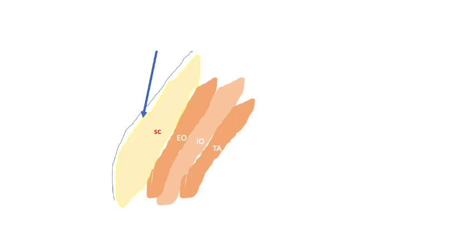So how to prevent this cushion effect? There are simple techniques. First is insert the needle parallel to the skin. So remain parallel to the skin first, pierce the skin, then make it perpendicular to the skin, then advance the needle, feel the bounce and pop of the external oblique fascia, advance the needle, feel the bounce and pop of the internal oblique fascia, and then inject the drug, and you are in the right plane below the internal oblique fascia, and here you will block the nerves and your block will act. So if you understand this concept, then you will never fail.